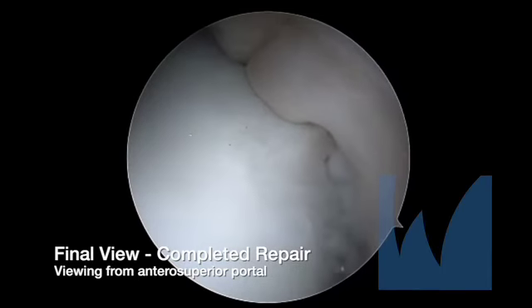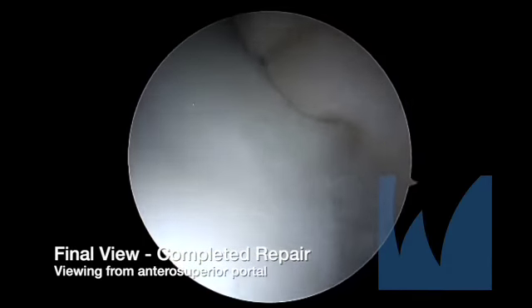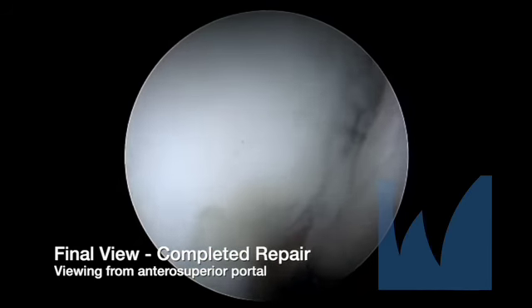Here we see the final view of the completed repair. Glenoid width has been augmented and the capsular tissue has been tensioned and shifted superiorly, restoring glenohumeral integrity.